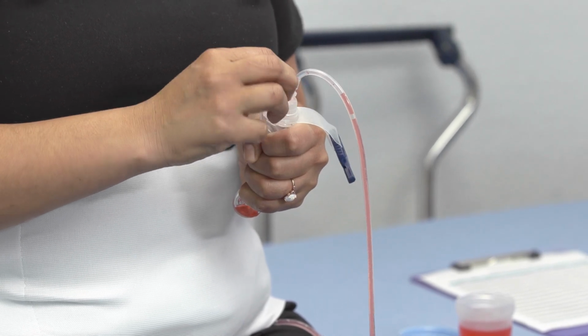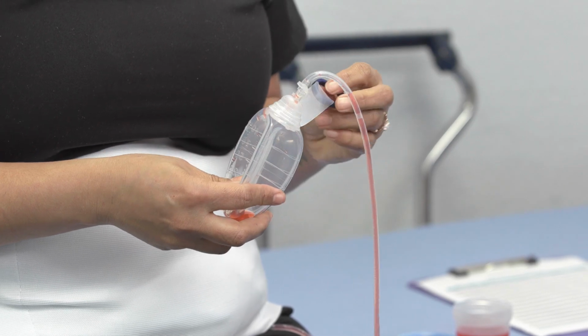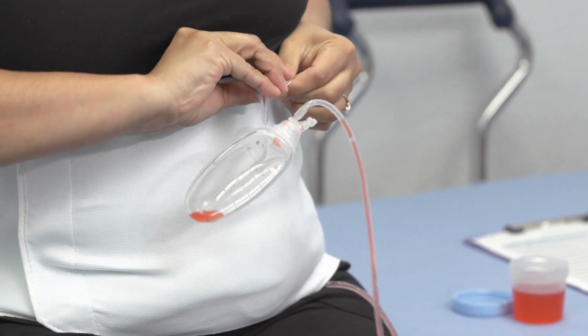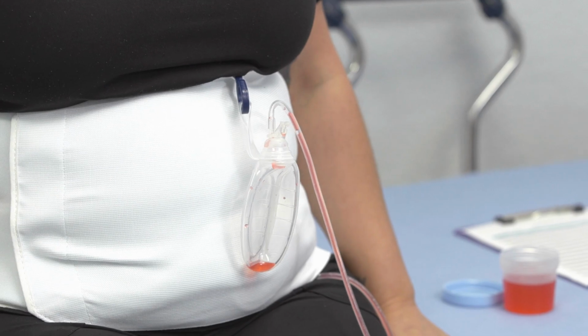You will then squeeze the bulb, compressing it completely. You will then replace the lid and let go of the bulb, ensuring that the suction remains by the compression of the bulb. You are then going to clip it back onto your surgical garment or piece of clothing, wherever you prefer, to ensure that it is secure and not hanging freely.